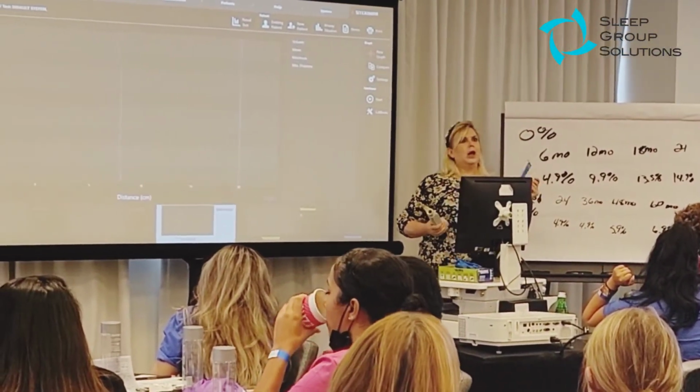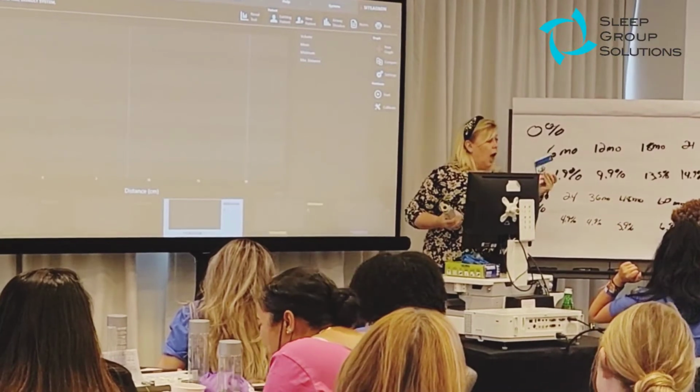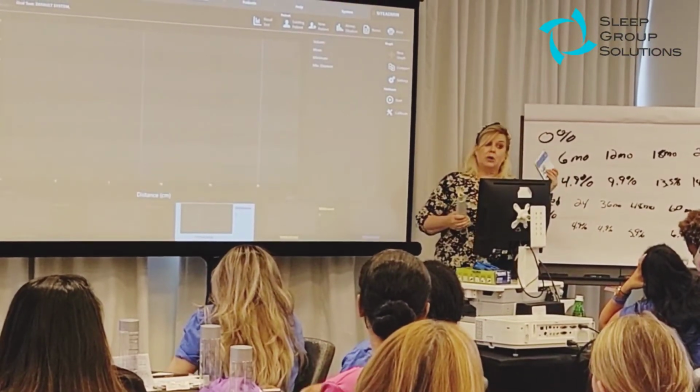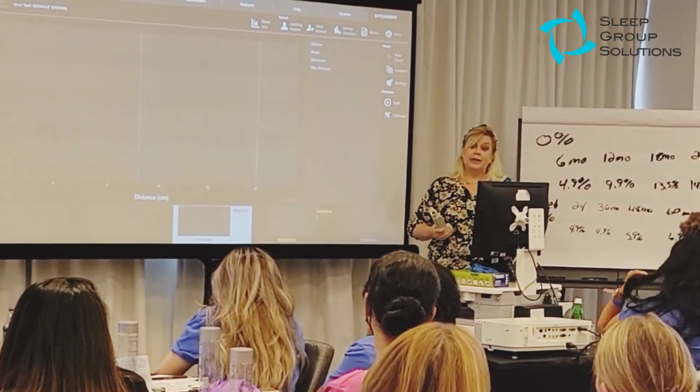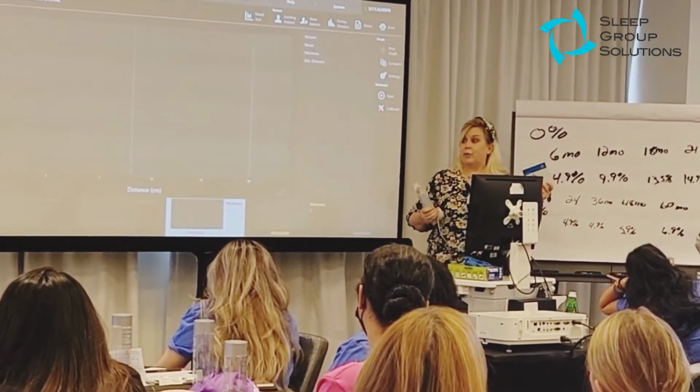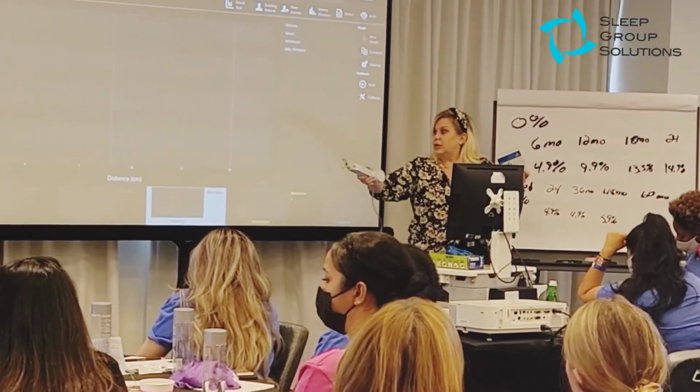I talk all the way long. Doesn't hurt me a bit. We chew, we eat. Vertical doesn't do anything to us. So if I can make an oral device that's more vertically based and less protrusively based, how much better is that for a patient?